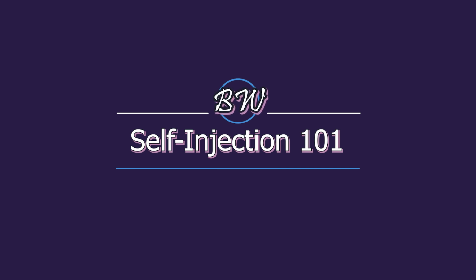I'm a board certified family physician and I love gender and reproductive health care. Today, let's learn about self injection as an option for hormonal affirmation. Both estrogen and testosterone can be injected once weekly, either subcutaneously or intramuscularly. I tend to prefer subcutaneous because it involves using a smaller needle.